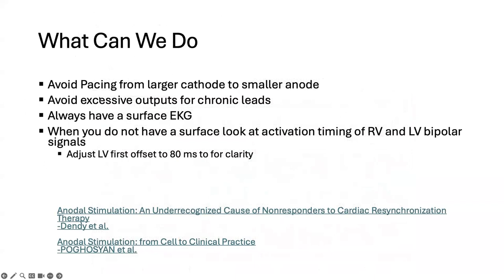So just to review: avoid pacing from a larger cathode to a smaller anode, avoid excessive outputs, always have a surface EKG available, and then you can look at activation timing. There are some studies here. These are clickable, but feel free to just Google these studies as well.